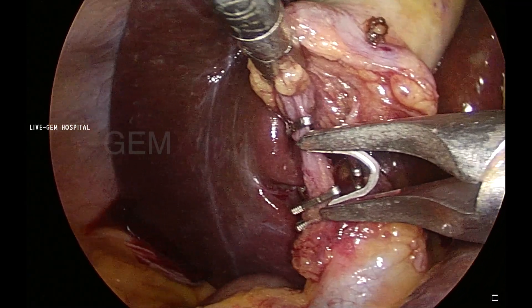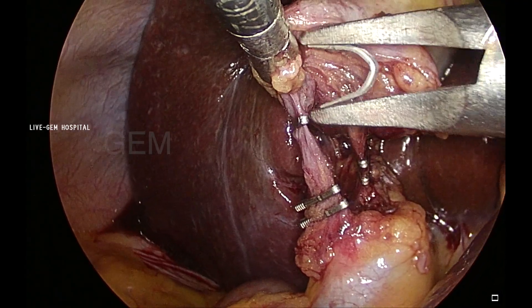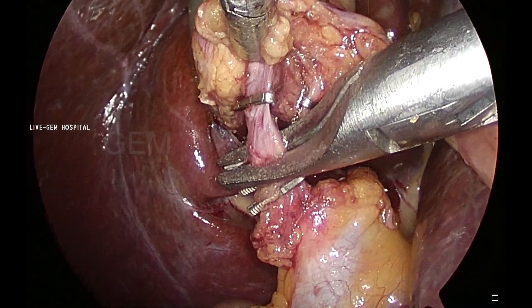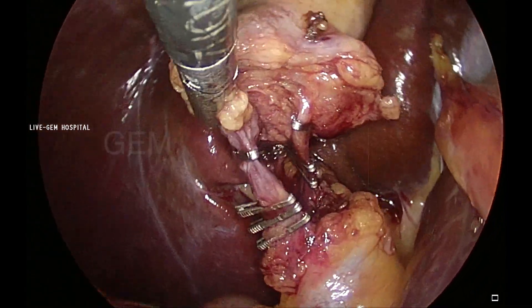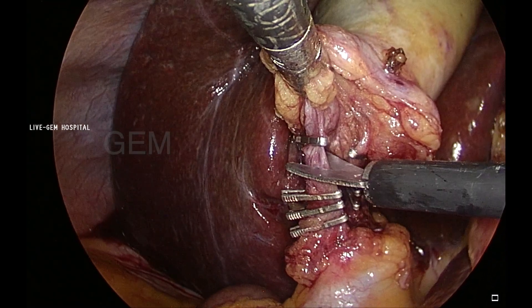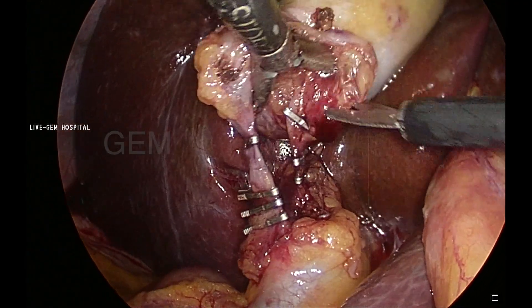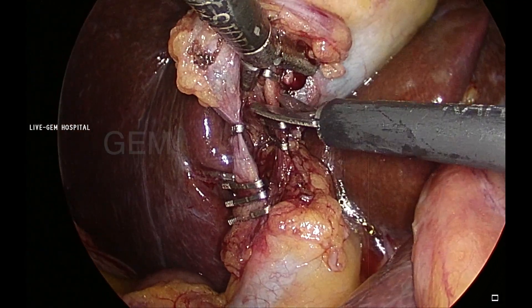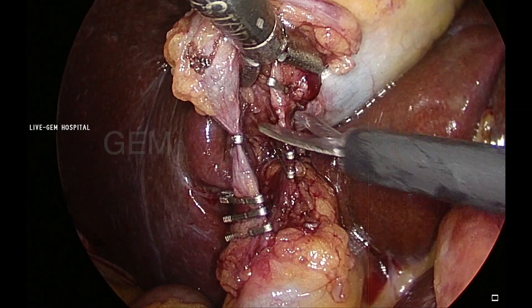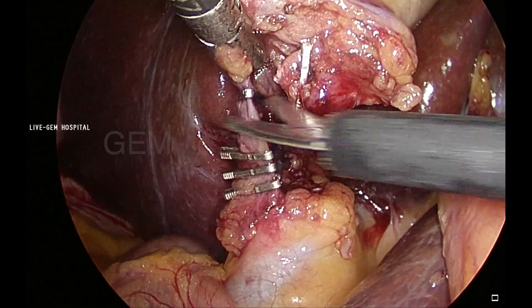If you have any doubt you can put another clip also — there is no need for three clips, even two is enough, but in this case I made an extra clip. I am following the basic principle here — dividing the artery first. Since I made a clip above and below, I am dividing with scissors without any energy source. And then I am coming to the duct.